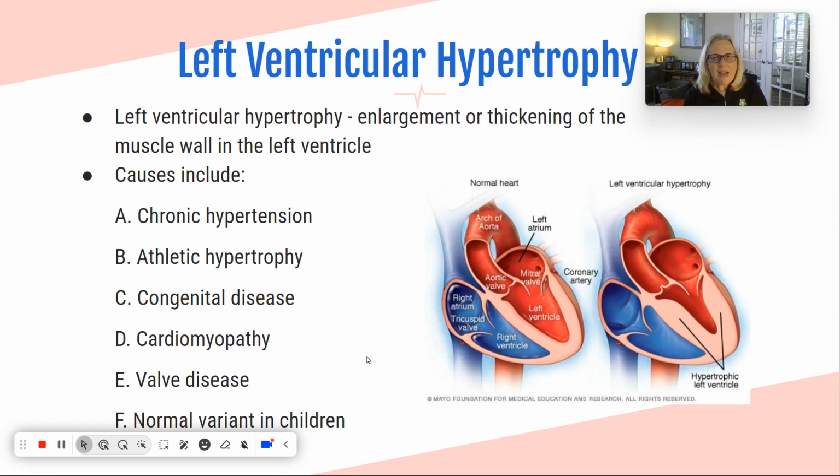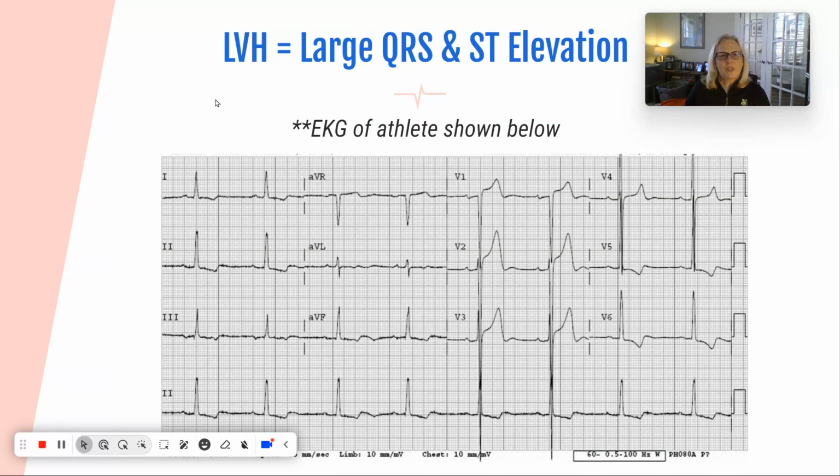Their QRSs, in fact, tend to be really skinny and tall. That's how you can tell it's a kid's EKG. Can't wait to show you those because these are really cool. You'll see the difference. Once you start looking at them, you're going to be like, hey, I can tell that that's a 3-year-old's EKG versus a 96-year-old EKG. Yeah. All right, so let's go through this.